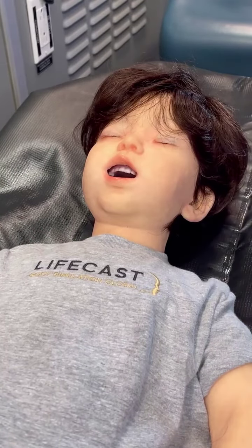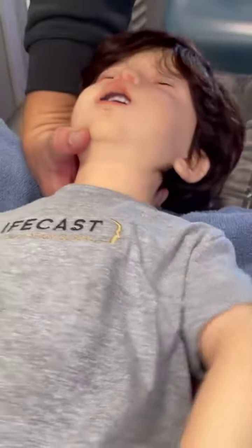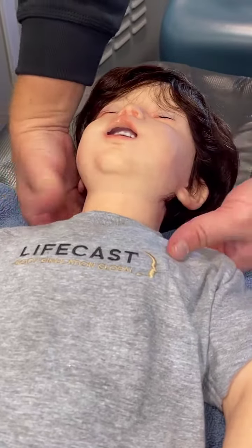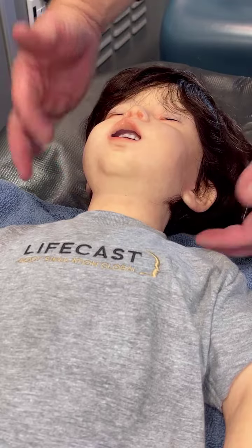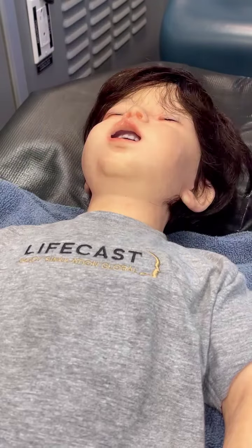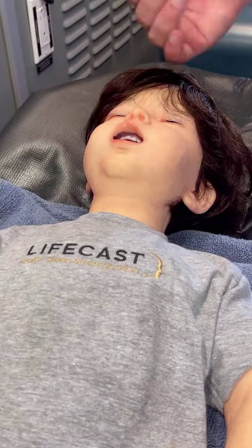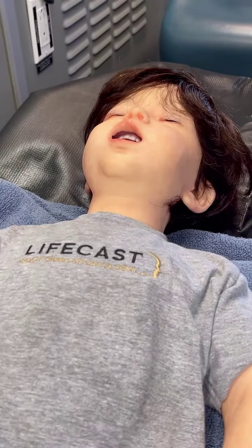So what do we need to do to help this patient? We're going to slide a towel underneath the shoulders like so. It doesn't have to be super packed, but enough to create sufficient space so that the head isn't crunched up and causing a collapse in the airway — keeping it open. Getting a blanket or towel underneath the shoulder blades, just enough to get them into a sniffing position so their airway isn't collapsed or crunched.